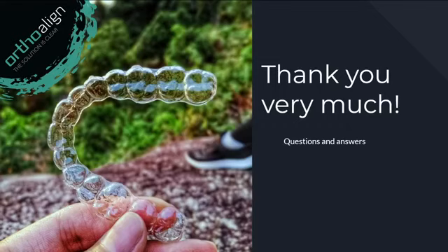However, if you do cases without attachments, you are probably going to expect to have to do more refinements of the orthodontic treatments at the end. Okay, so it is very important that you do note that. But if we're going to do without attachments, we can definitely do that. If you want to place all the attachments at the very beginning, we also can do that. If you want us to do attachments staggered across the treatment plan, yes, we can also do that.